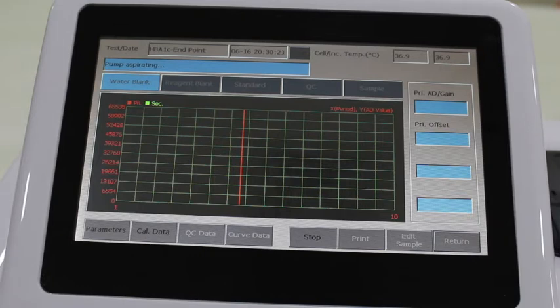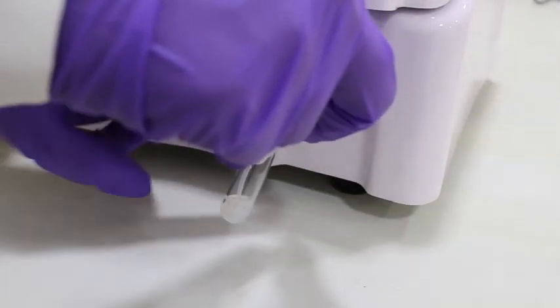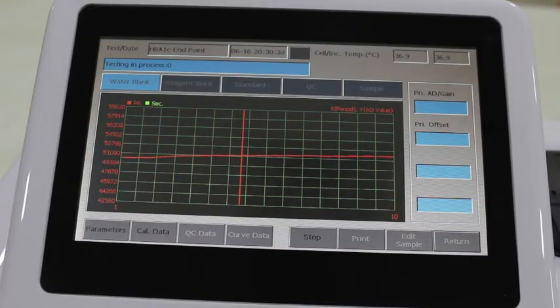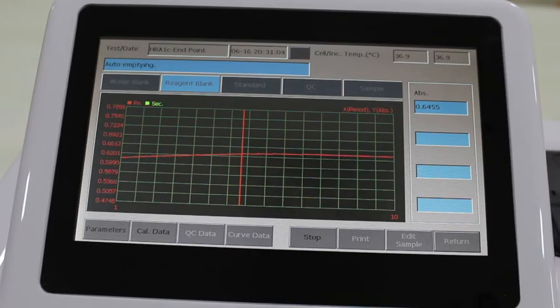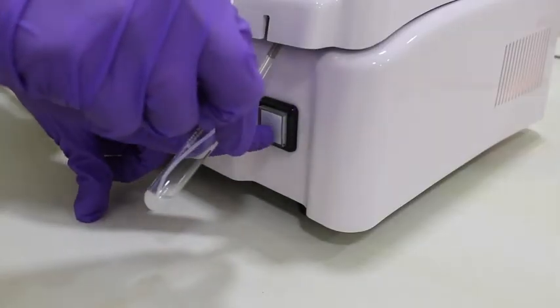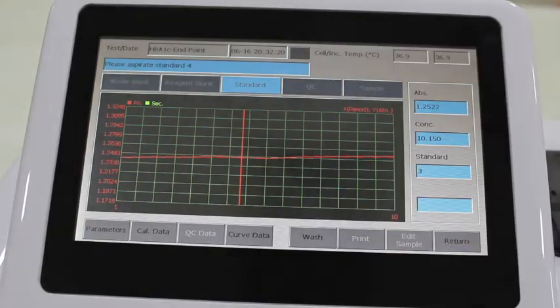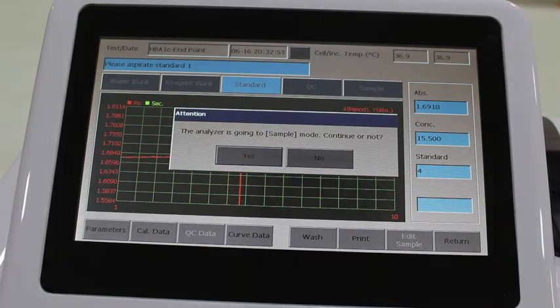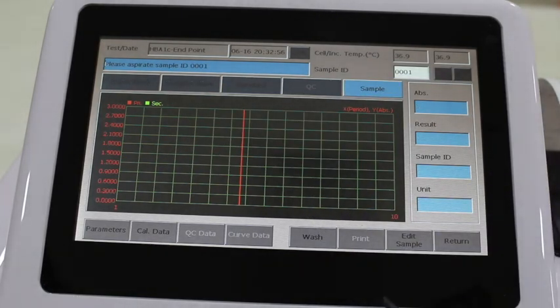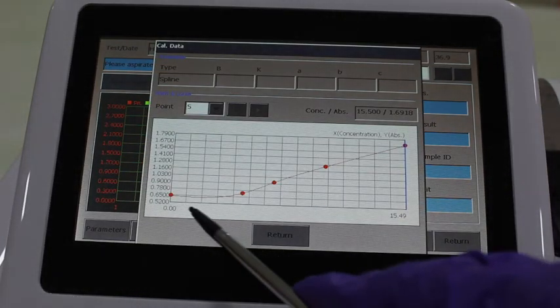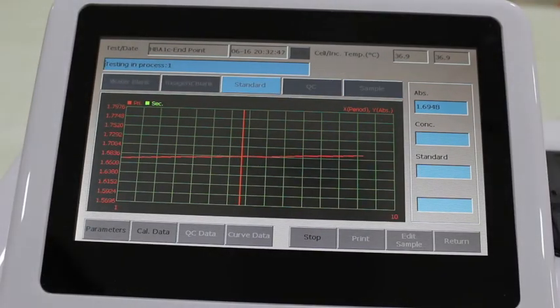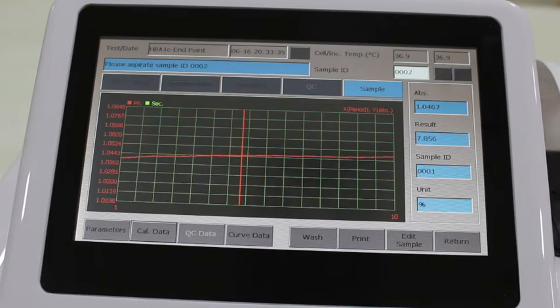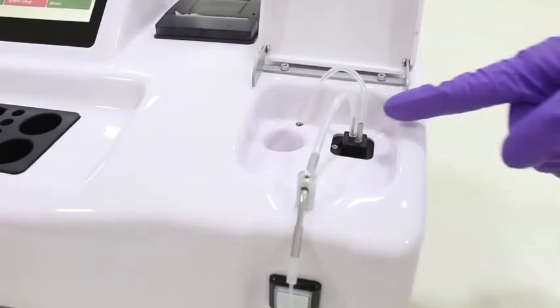Now select the test page. Run water blank as message appears on the screen, then run reagent blank followed by other calibrators one by one. Check the calibration curve. The instrument gets ready to go to sample mode. If the calibration curve is good, then the sample can be run. The sample is run and the results are displayed.